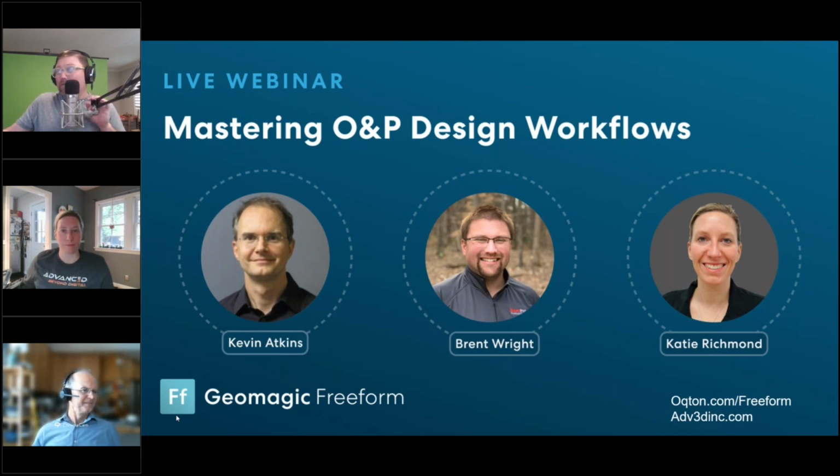I mean, you're absolutely right that there's not a lot on YouTube, and I think it goes back to your point: the people that use Freeform, the industries are so diverse that while some of the tools maybe are used, the workflows are different. And so, we're going to try to put out as much information out there.